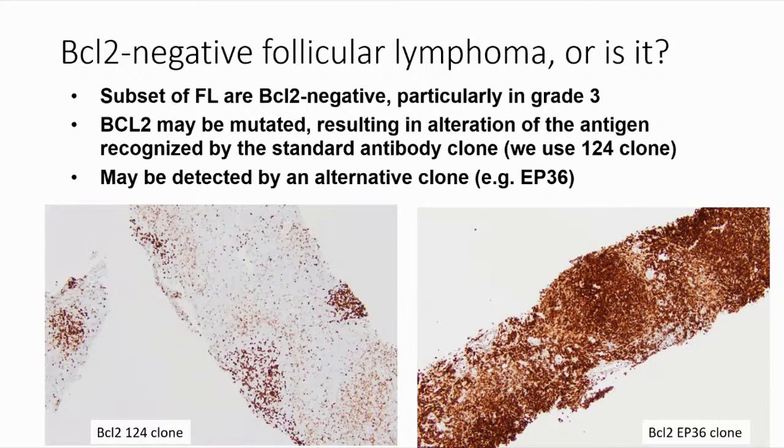Right. So here's one question regarding lymphoid follicles or lymphoid aggregates in colon biopsy. Often there are lymphoid aggregates in colonic biopsies, which raise the suspicion of a lymphoma process. What is your advice for a standard panel to approach this when you have a lymphoid aggregate in a colonic biopsy and we want to rule out lymphoma? Yeah, these are challenging because we normally see reactive follicles in the colon.